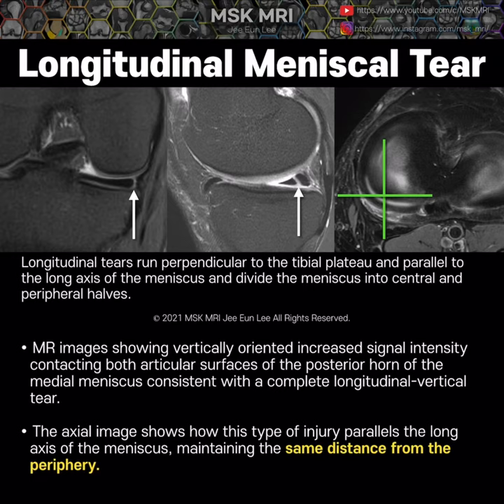Hi, this is Yenri from MSK MRI. Let's talk about the longitudinal meniscal tear. Longitudinal tears almost always involve the posterior horn in both the medial and lateral meniscus. Their diagnosis on MRI is by presence of a vertical line of high signal intensity contacting the superior, inferior, or both surfaces of the meniscus.